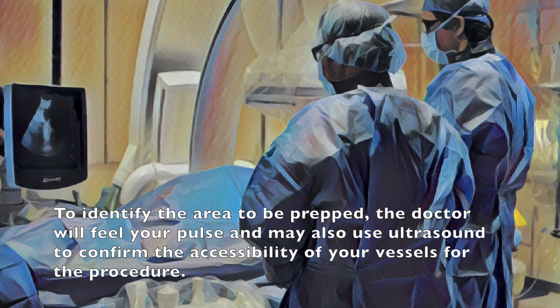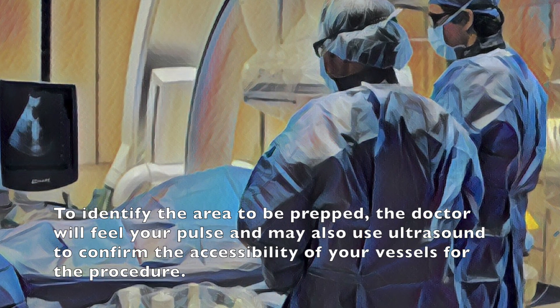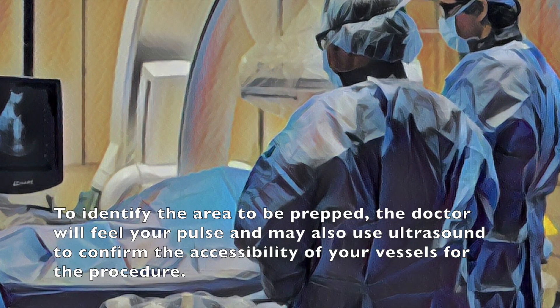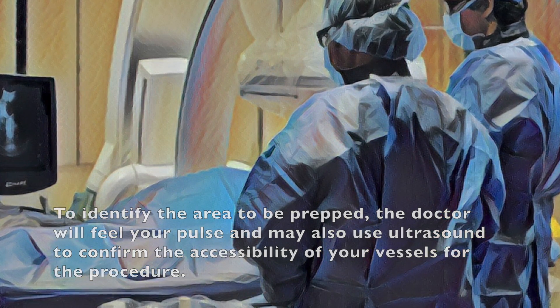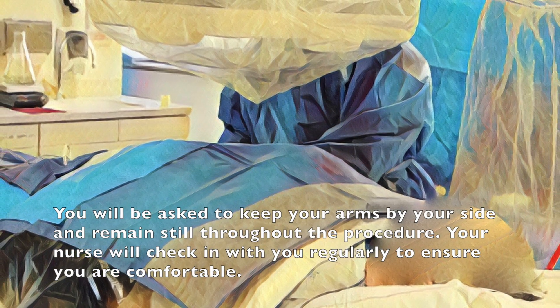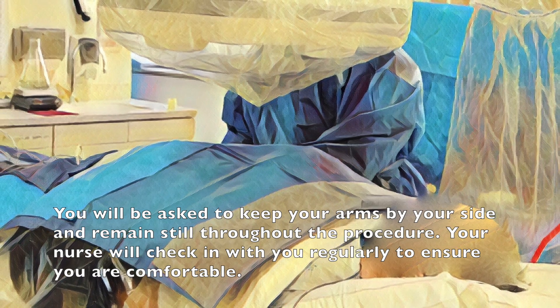To identify the area to be prepped the doctor will feel your pulse and may also use the ultrasound to confirm the accessibility of your vessels for the procedure. You will be asked to keep your arms by your side and remain still throughout the procedure. Your nurse will check in with you regularly to ensure you are comfortable.